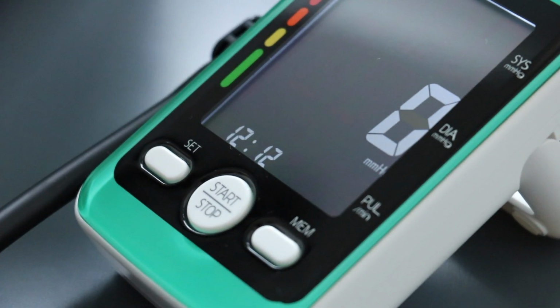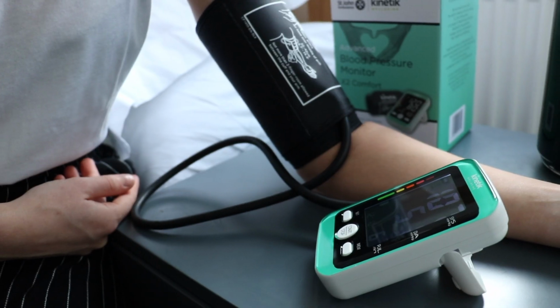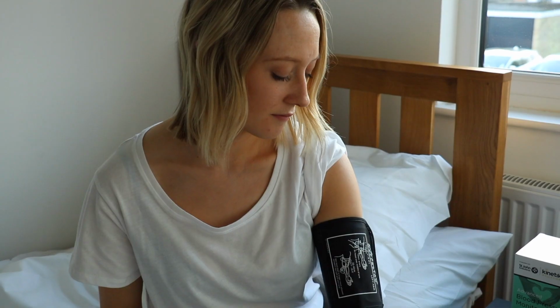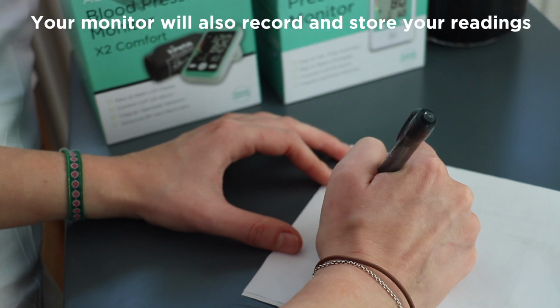Step 3. Press start. Don't talk and relax as the cuff inflates. Step 4. Repeat. Record your first reading, then take 2 or 3 additional readings, each about 2 minutes apart, and then work out the average.